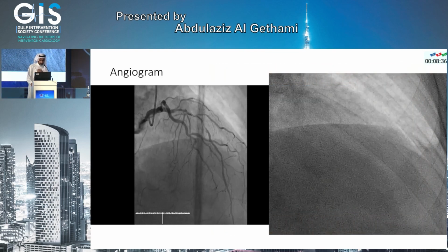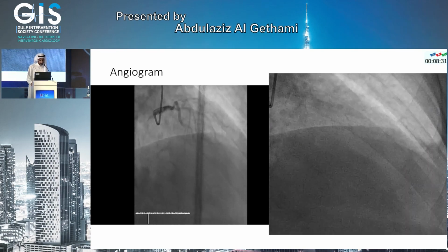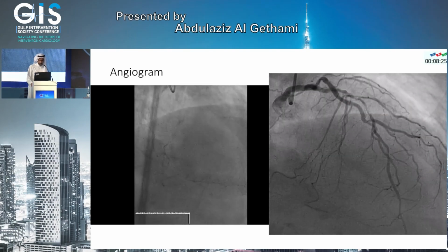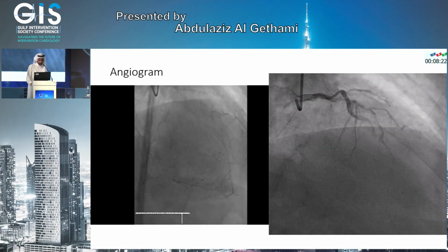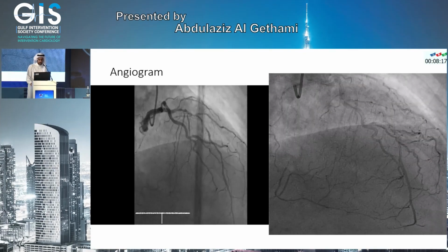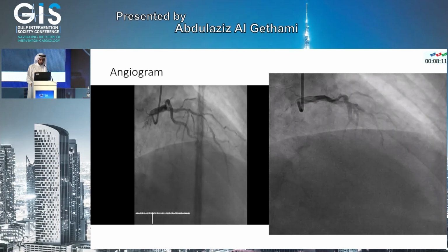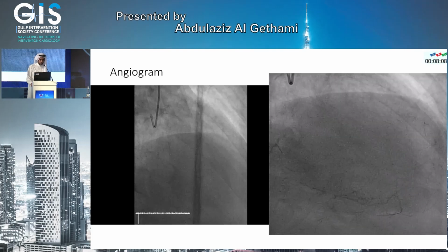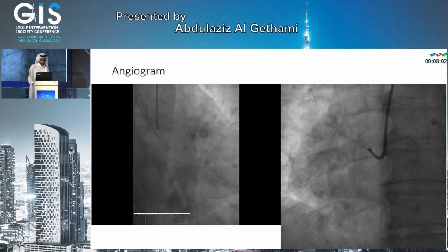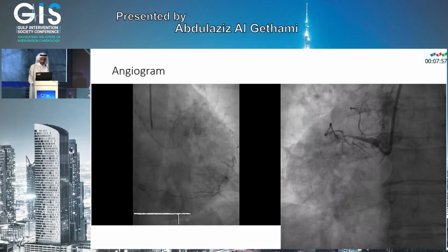So this is her angiogram. As you can see, there is a long calcified lesion in the LAD. It also involves a medium-small diagonal. The circumflex seems to be fine in this view; we'll see a different view for that, but it does supply the RCA, which appears to be a likely CTO. We did not do many views because, as you know, the eGFR is only about 19. So we did the cranial and caudal. There is also a lesion in the circumflex of about 80%. The RCA is a CTO with some antegrade and retrograde filling.